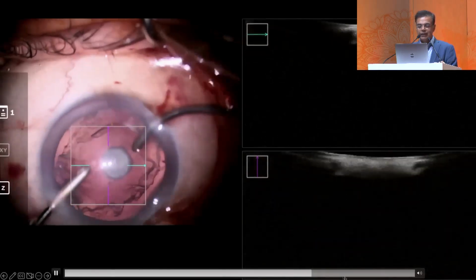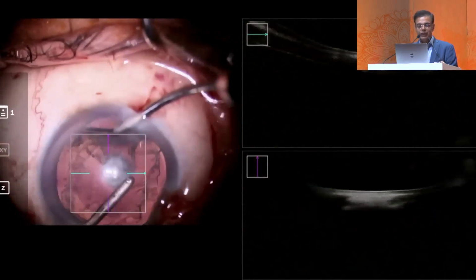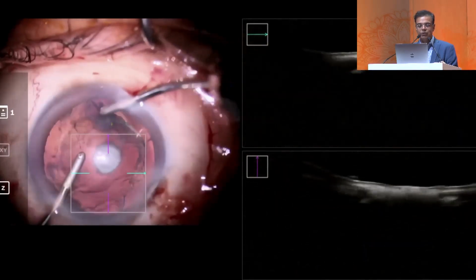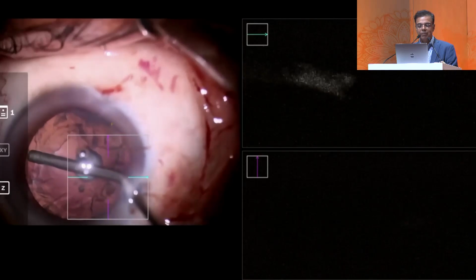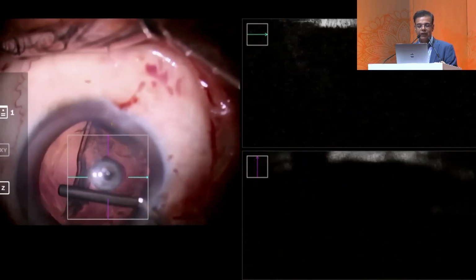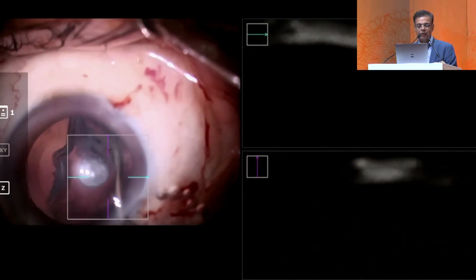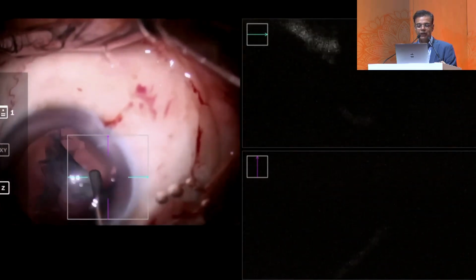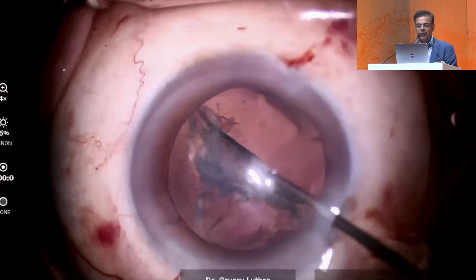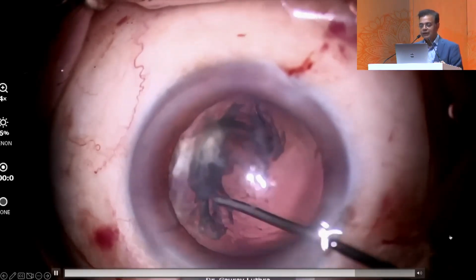So in that sense, the femto-assisted laser becomes very, very useful, but you have to be careful. See, I'm not even now ready to go very close to that, and it's only towards the end when I'm sure that I've removed, debulked it completely. Now I'm going to do a visco separation. I'm pushing viscoelastic from the periphery, lifting up that small epinuclear plate, and then ensuring that I'm not going to aspirate it. I'm just going to gently move it to one side and see that it separates. Usually it separates very well, and you can see here that now we've been able to get it off without creating a break, and this really becomes useful.